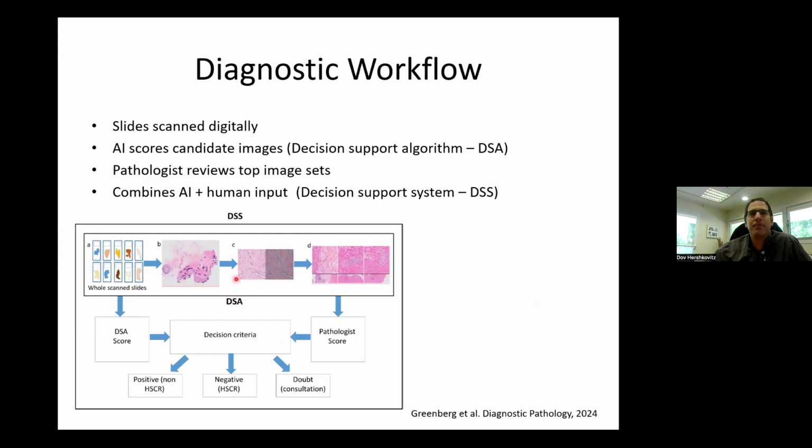And as Rami said, instead of dozens of slides and a huge area that we need to scan, the algorithm reduces it to a few small images with high magnification of the area suspected for ganglion cell, and the context. So instead of a huge area, it's one PDF with a few images of the best ganglion cells suggested by the algorithm.